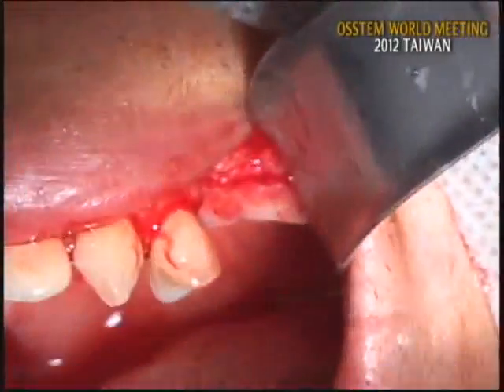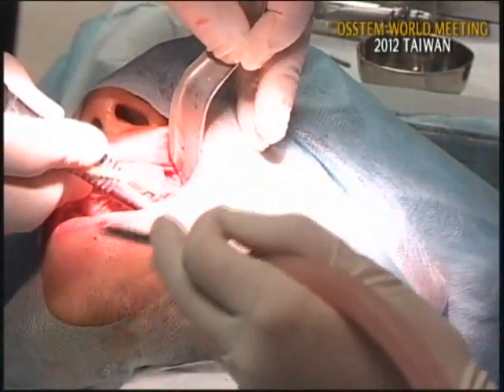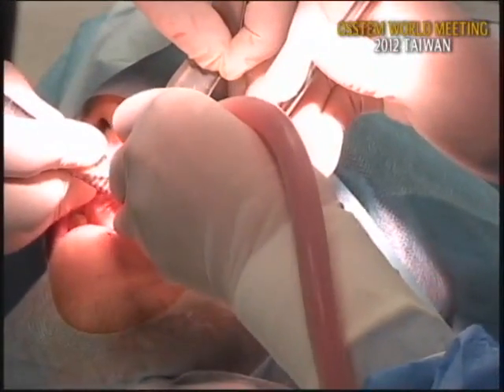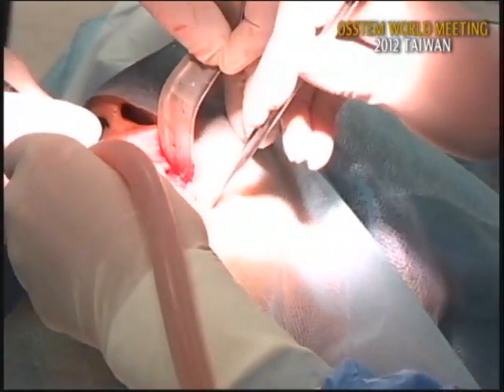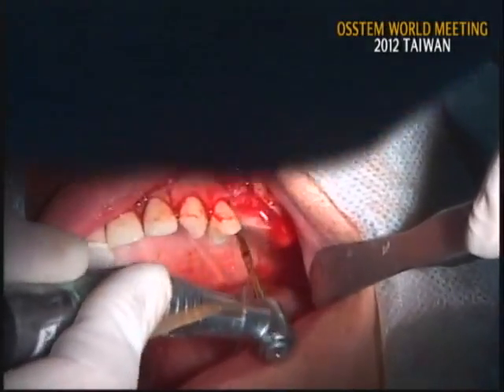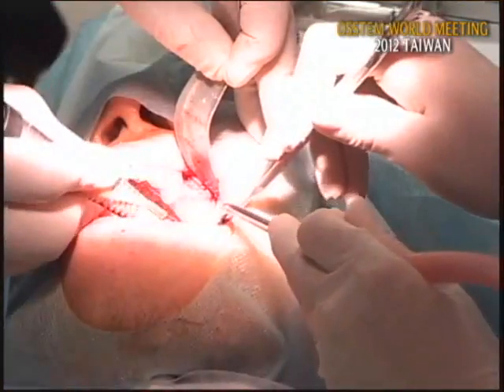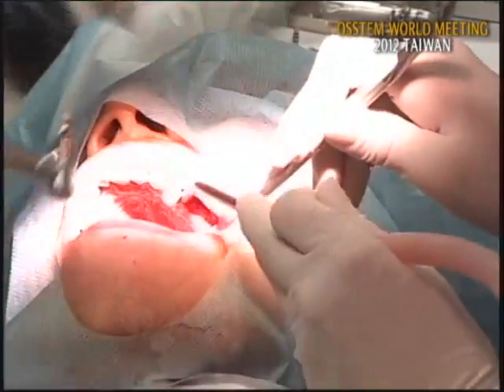Let me check the last position. Close, close, open. Okay, it's good. Carefully advance the drill until you penetrate the sinus floor. The anterior bone is relatively sufficient. The posterior molar site, okay, bone is not enough.